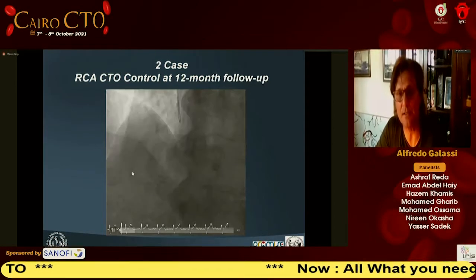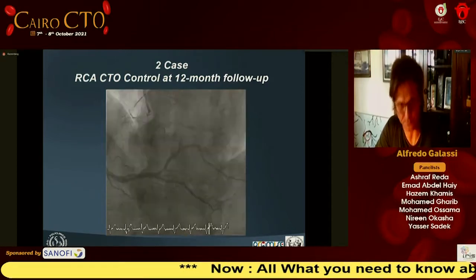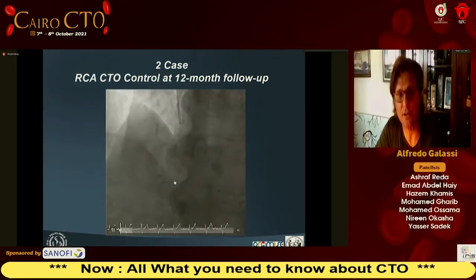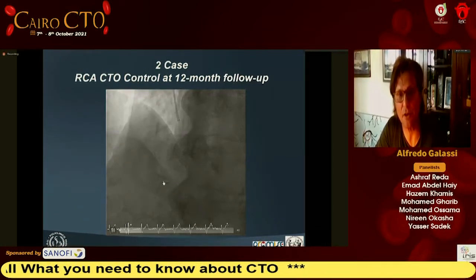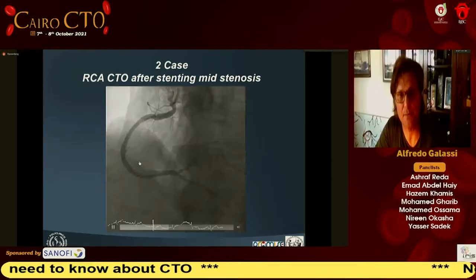In this case of antegrade dissection re-entry, angiographic follow-up is a must and should be done in the proper way in order to fix this focal restenosis. You can also see some additional flap of dissection re-entry, but this is not limiting flow. And then this is the final result after the stenting of this area.